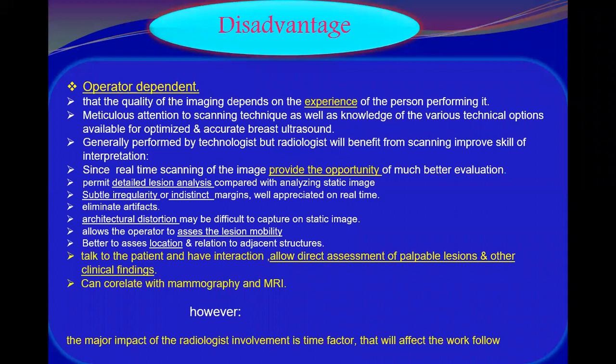We describe a lot of technical options and how they can help us in doing breast ultrasound. We have to know a lot of technical options that can help us optimize an accurate ultrasound image, to improve both sensitivity and specificity.